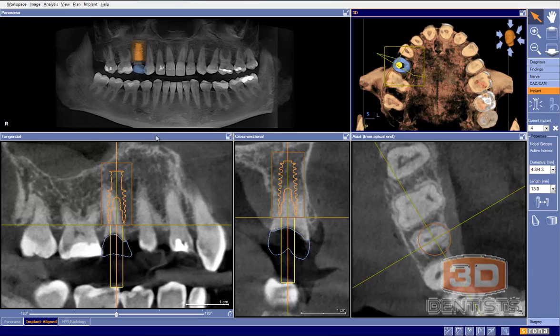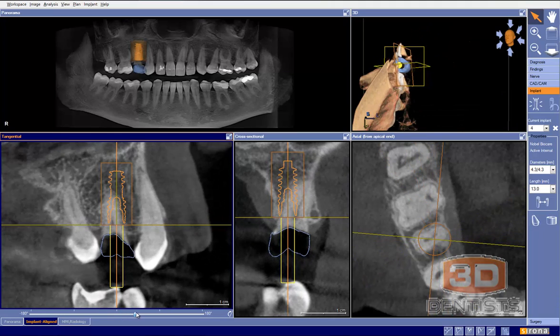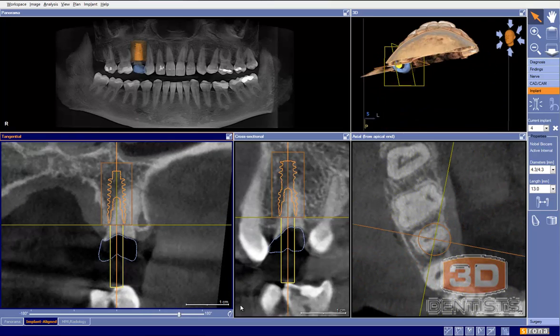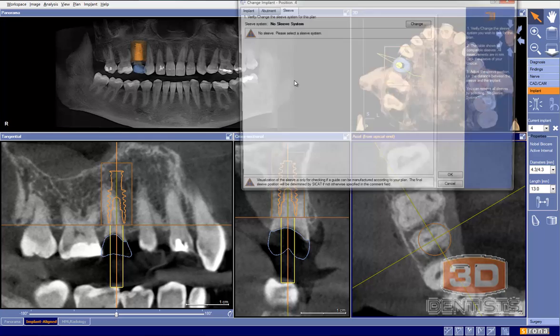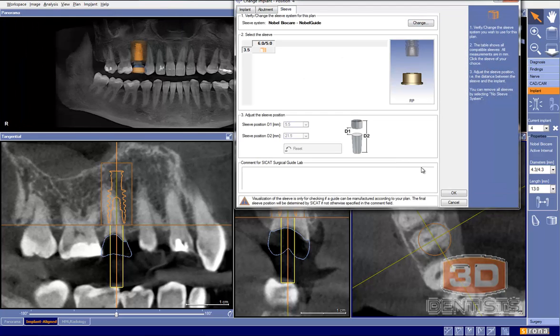Again, thank you for sending in the plan. Hopefully this is helpful and makes sense. The last thing I want to do is go through a 360 and make sure there are no dehiscences in the bone or any areas where it gets really close. Here I'm sliding through and everything looks pretty good. This should be a relatively straightforward immediate implant placement without big issues. Thank you again for sending the case in, and we look forward to helping you along the way.